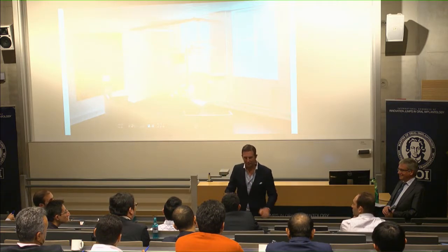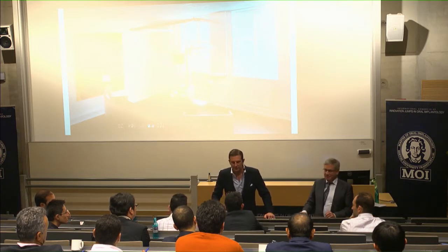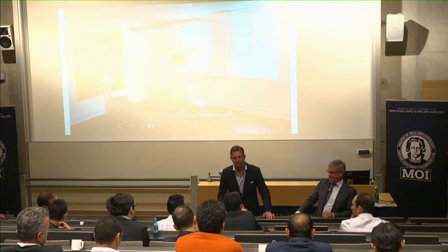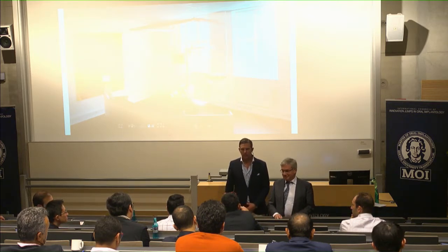From my experience with this case, I will use the laser to reduce the gum first, and later I use the ultrasonic with the diamond cutting. Yes. And go subgingivally to reduce the bone. Go into the sulcus. Yes, just into the sulcus, so no flap at all. And after that I do one pressed suture on one side and it's enough.